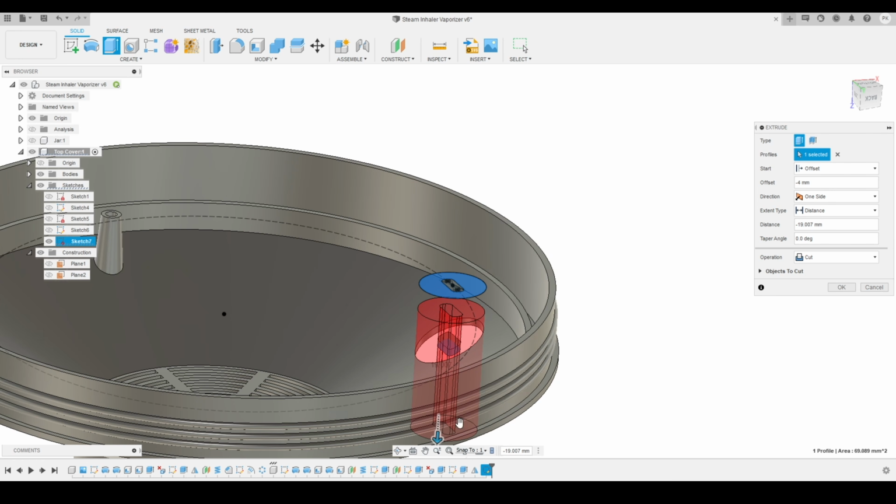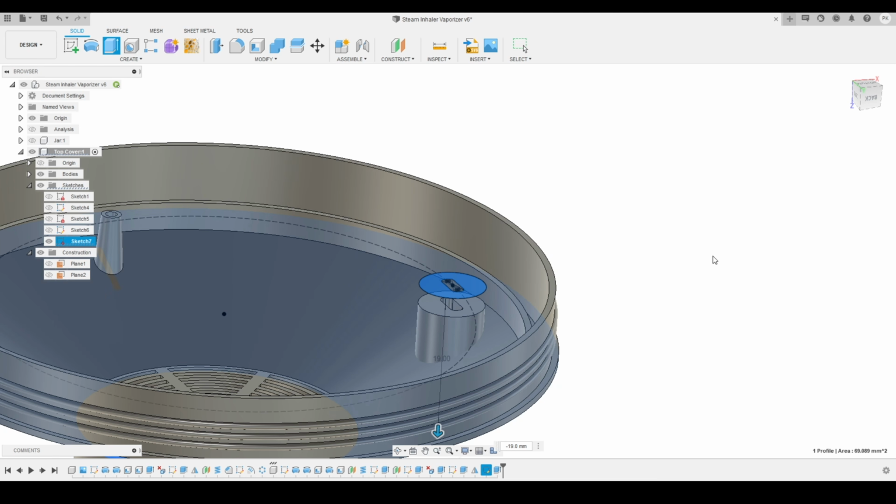So here you can see this is what we are getting, and if I change that to join operation or new body, it is going to look like this. So I think this is pretty much the result we wanted. Before we press OK, I have to make sure that the distance is exactly -19 and this one is just -3, and we'll press OK.